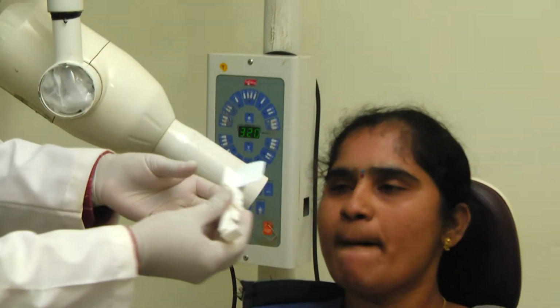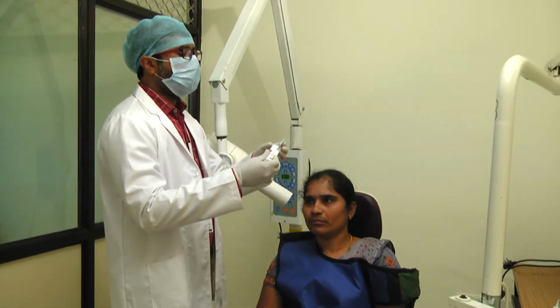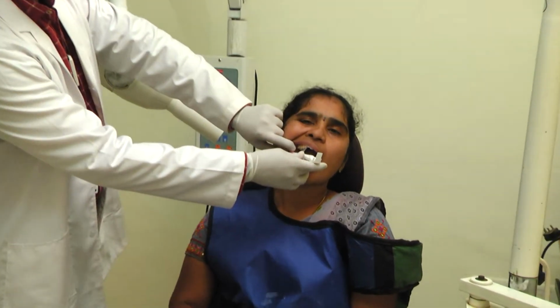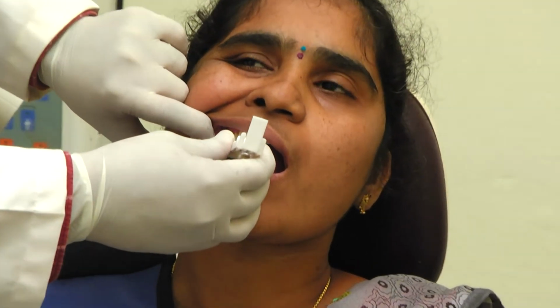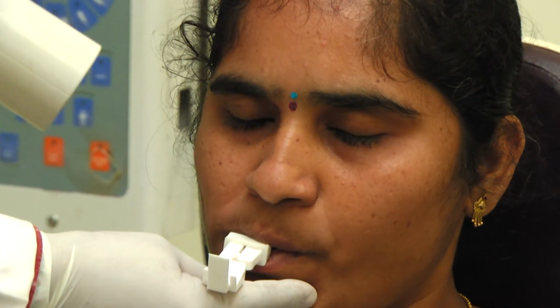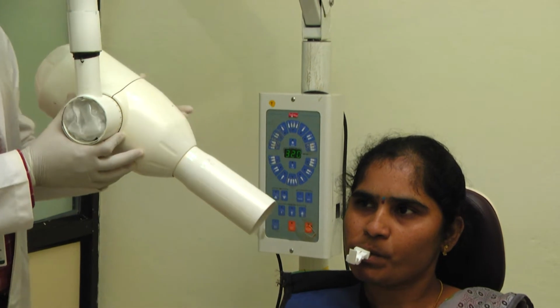And the same principle again for the maxillary molars. The placement of the film is the same, with the raised dot towards the occlusal surfaces, and then ask the patient to open wide and insert the film, covering the first, second and third molar. Once it is properly kept, ask the patient to bite on it. Then the patient's head should be adjusted in the upright position and adjust the angulation. For the maxillary molar, the angulation is positive, that is plus 20.